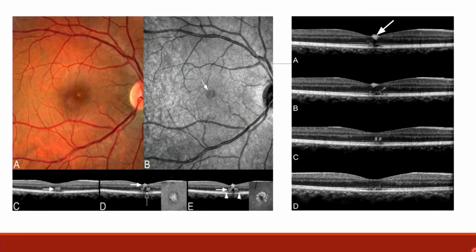So in their case, the patient had a hypopigmented patch near the fovea, which corresponded to the infrared image also. The OCT shown below has this hyperreflective lesion just above the ELM, and D and E are the other two patients in the same series. These hyperreflective globular lesions were reaching up to the ILM, and even in the D and E cases reaching above that. While we can see the RPE is completely intact and there is no transmitted hyperreflectivity below the RPE.